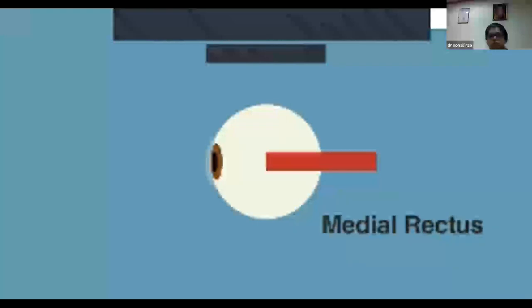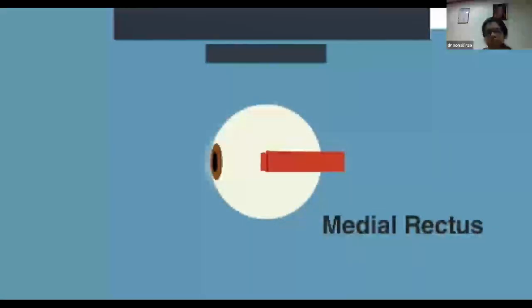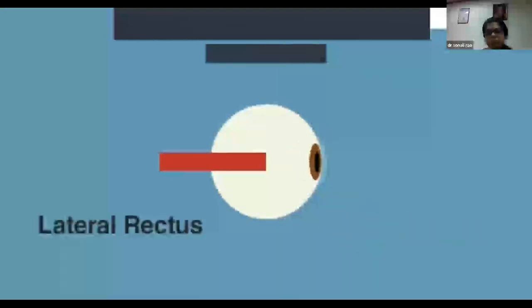Since the child did not have binocularity, we chose to go with surgery, and a decision to spare the inferior rectus was made as the muscle would be needed for reading. The plan was to correct exotropia and hypotropia first in the right eye. In this surgery, the medial rectus was approached by a limbal conjunctival incision and plicated by 6 mm, followed by approaching the lateral rectus by a limbal conjunctival incision and its recession by 9 mm. Thus, the exotropia was corrected.